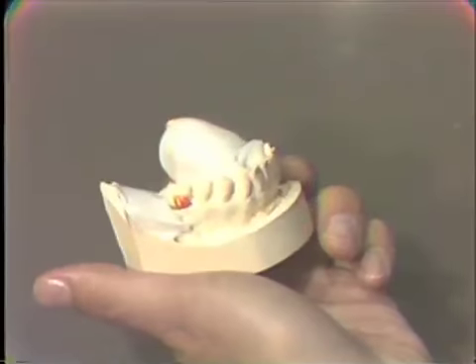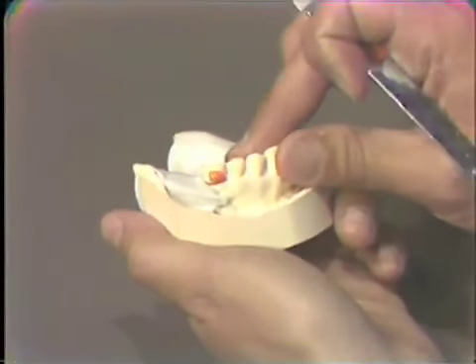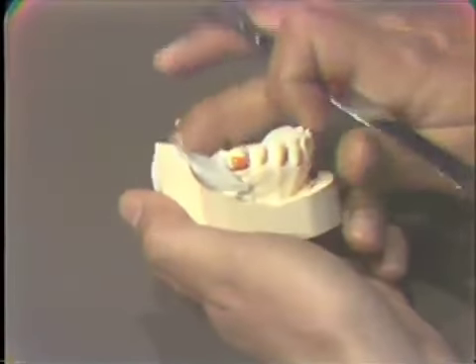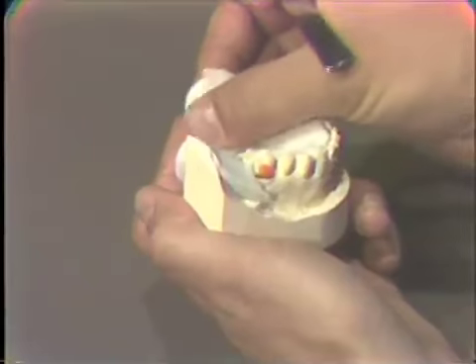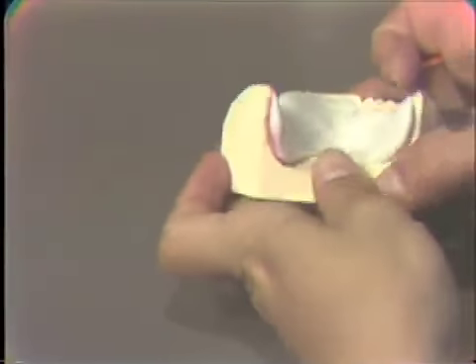Remove it and then let the material sit. And as the material is polymerizing, I would continually try to keep it adapted, or else you will get some sort of bounce from the material as it shrinks during its contraction. Okay, now I would just continue to trim and let this set.